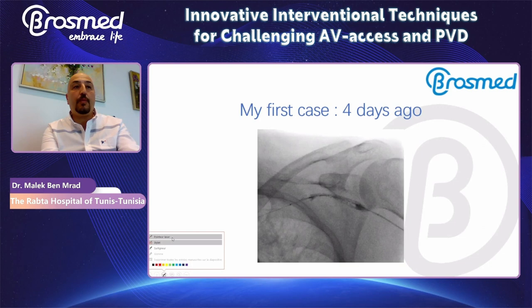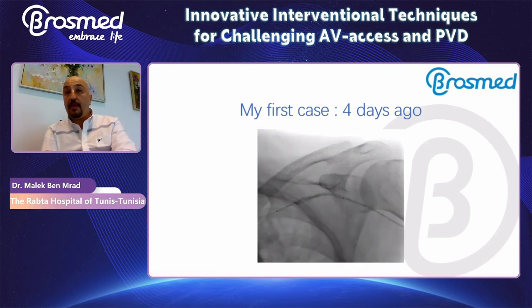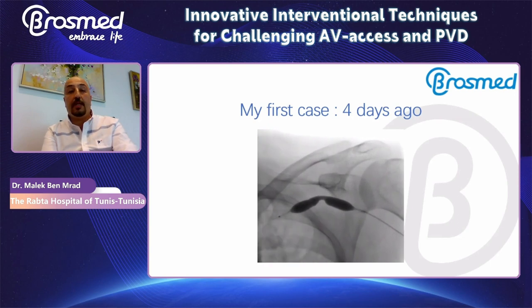We initially inflate the balloon to 8 atmospheres, the nominal pressure. You see here the inflation of the balloon at 8 atmospheres. It's the nominal pressure of this balloon, but we have the same result. It was impossible to overcome the lesion.